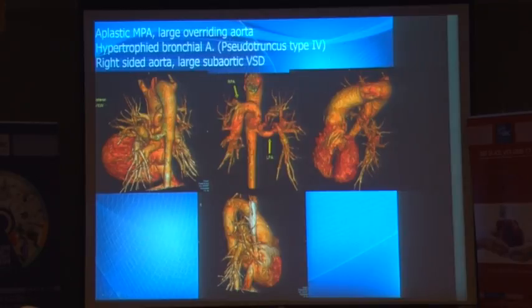Again, another case, sub-millisievert dose, below 1 millisievert. You see the quality of images, how amazing it is. This patient had no pulmonary artery. And here, the right and left pulmonary arteries are directly arising from the aorta, as you can see here. It's an amazing and very rare case, a pseudotruncus case.